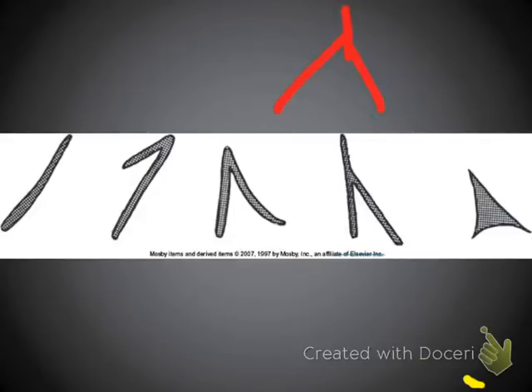Also, sometimes it's very difficult to discern abnormalities on the adrenal glands. If one side is thickened, sometimes you'll see a large area of thickening here on an adrenal gland. And so sometimes it becomes necessary to look at it in multiple planes just to see if there is an abnormality, or it's just the plane that you're going through that makes it look like this. But always be looking in your abdomens for an upside down Y, because that will denote to you what is actually the adrenal gland.